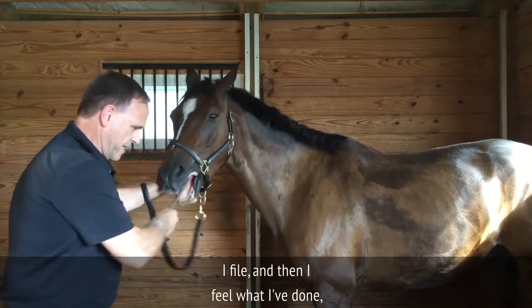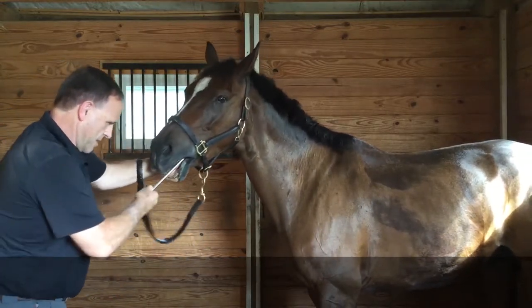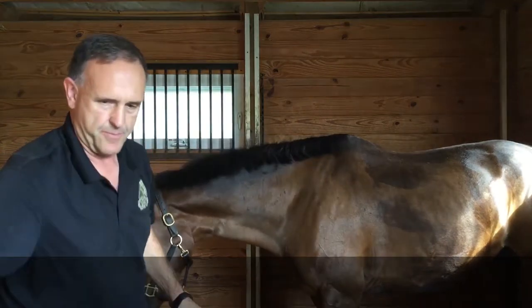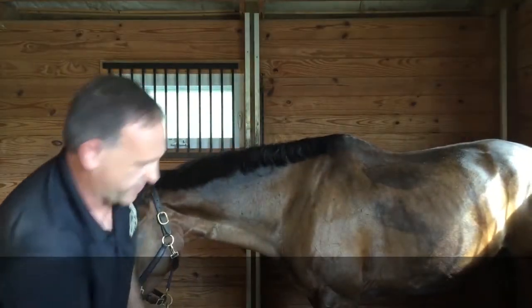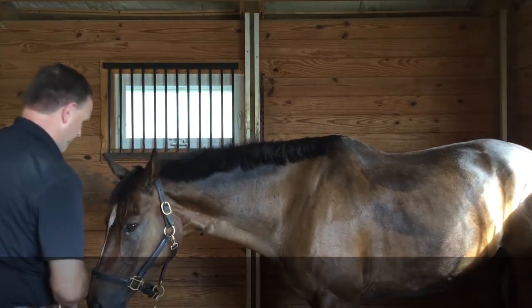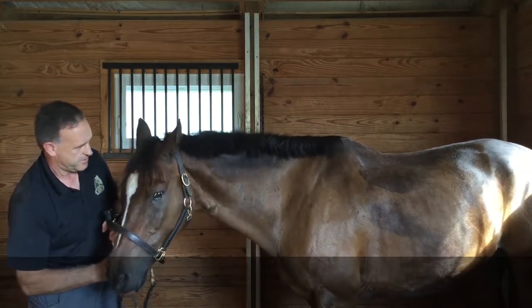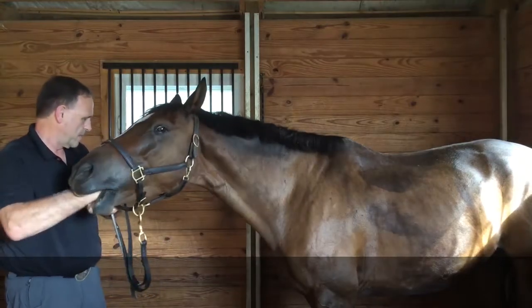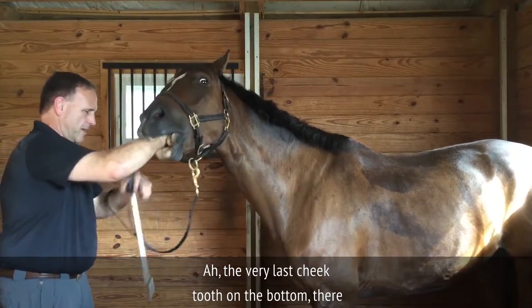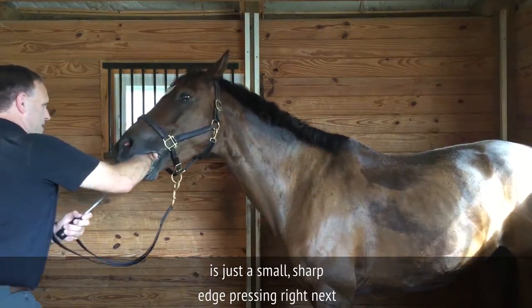I file and then my finger neatly feels what I've done — it determines whether I go back and do some more. There's just a little resistance, but it's no big deal. Now we'll do the other side. The very last cheek tooth on the bottom.